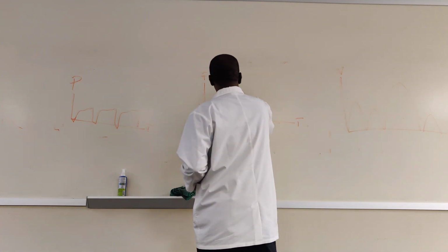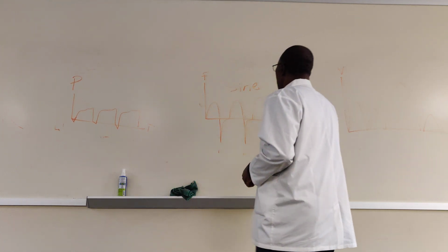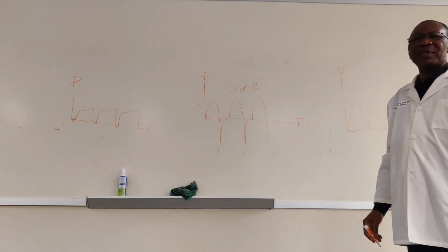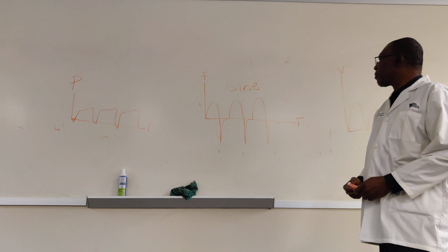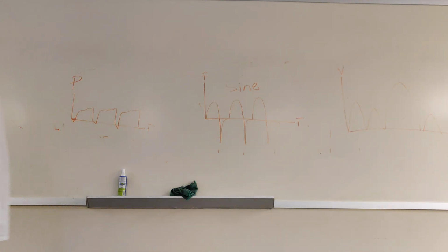We'll call it the sine. Is that how you pronounce that, sine? That's what I've always said. That's what I always call it, sine. It's not direct sine, but this sine here, sine flow pattern. Okay? Any questions about the scalar?